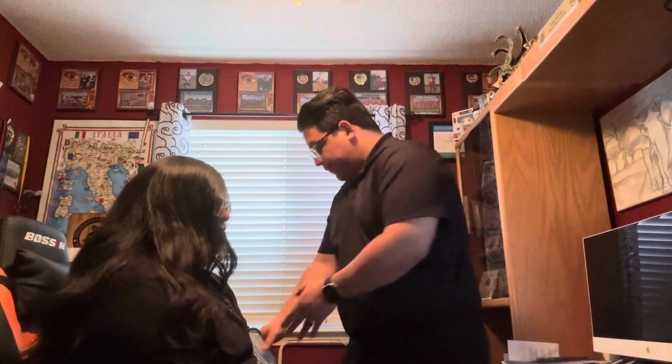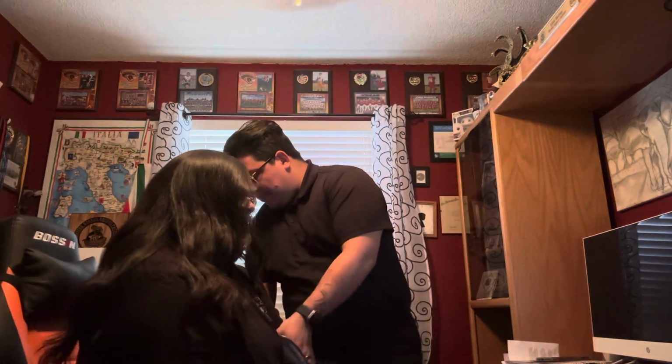Okay. After measuring it for 30 seconds, I'll go ahead and multiply that by 2. Since I had 32 beats in those 30 seconds, multiply that by 2, it'll be 64. Over here, our blood pressure is reading 125/80 with a heart rate of 64.